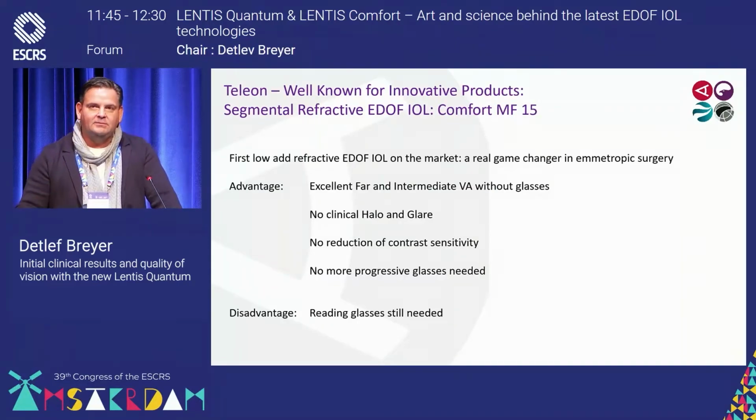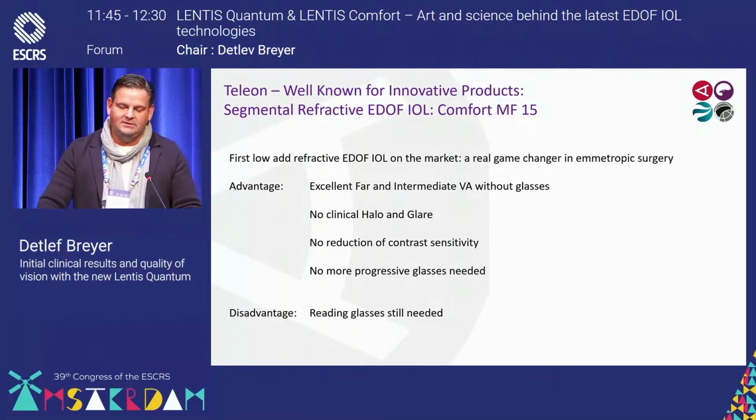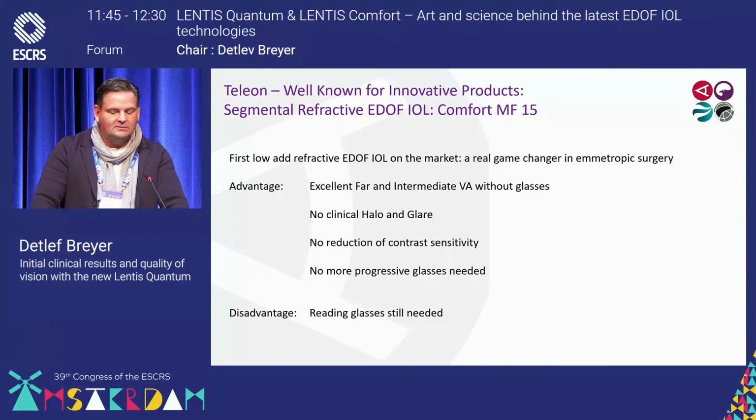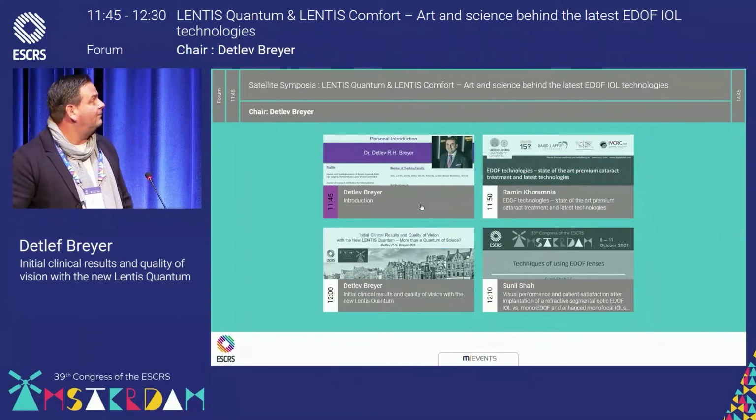So let's go a little bit to the history of EDOF technology. I started 10 years ago, and it was really a pleasure to listen to this excellent overview, scientifically wise, from Ramin to guide us through EDOF technology. And 10 years ago, I had the big luck to implant one of the first Comfort IOLs, which was a segmental IOL with a near addition of plus 1.5.